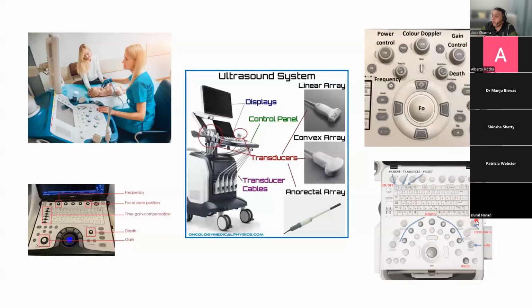You also have a focus button. And a focus button, from our perspective, is not present in modern machines. So at the moment, we don't need a focus in the GE, we don't need a focus in the Sonosite. And really, what I'd say is even in the Philips, you don't need focus buttons. And the reason for that is because the probe tends to automatically adjust and optimize focus at each focal point whilst you move the transducer back and forth. So it produces the best focus for that range. And in those situations, if you really want to optimize your image, the way to do that would be by changing frequency instead. And that depends on the depth at which you're really looking for the image. So you might have to alter those buttons instead of having a focus.